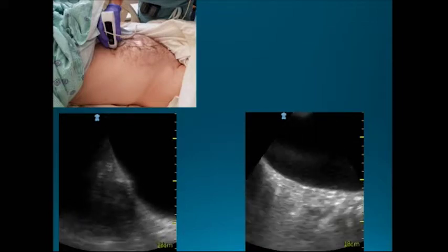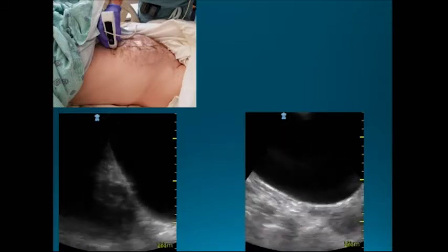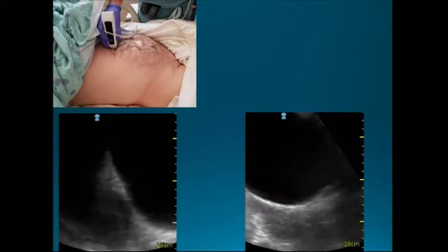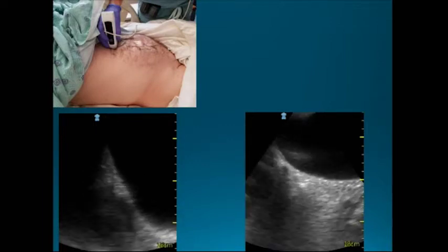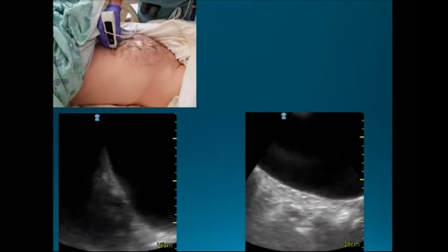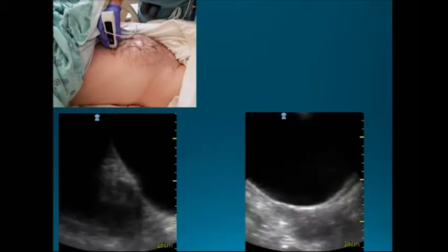Where this is also helpful is in people who you're doing a bladder scan on, and they're saying there's lots of fluid in the bladder, and you put in a Foley and you get only 50 cc's out. Like, what the heck? A lot of times the bladder scanners can't distinguish the bladder from ascites. And we've actually seen a person have their very empty bladder perforated from a very aggressive Foley catheter because you're trying to go into an empty bladder, and the whole time the bladder scanner's greater than 999 because the belly's filled with ascites.